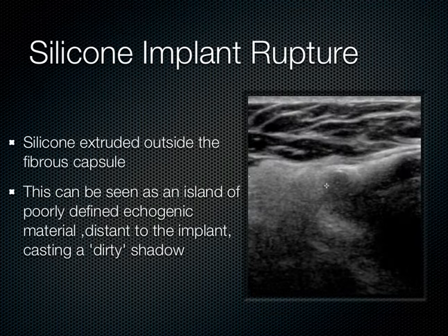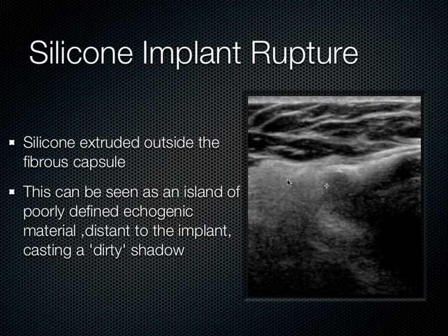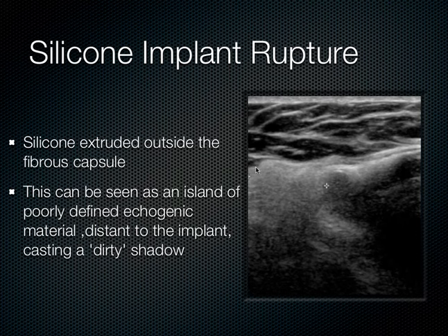When rupture does occur, with a silicone implant the silicone extrudes outside the fibrous capsule, appearing as poorly defined echogenic material distant to the implant with a dirty shadow — a sign of silicone implant rupture. If it's a saline implant rupture, it looks like anechoic free fluid seen in different tissue layers.